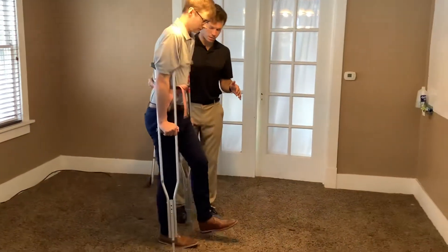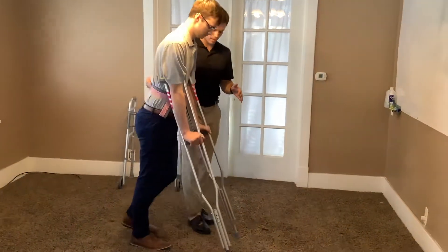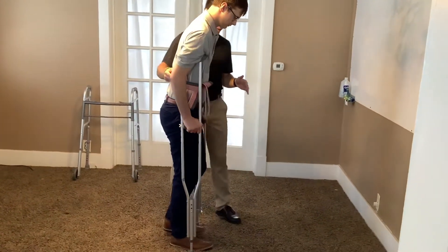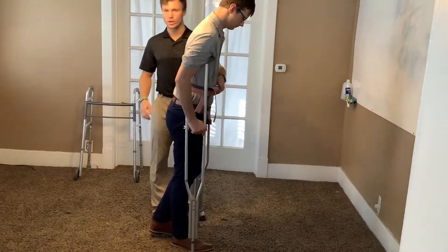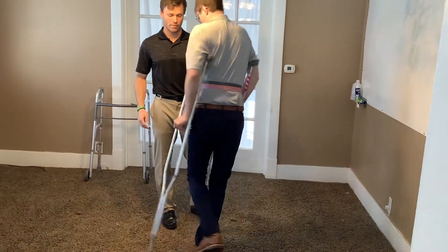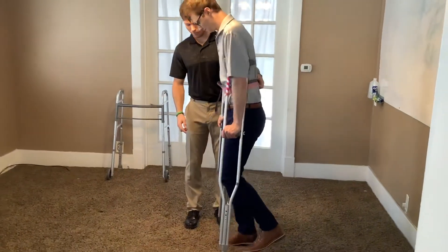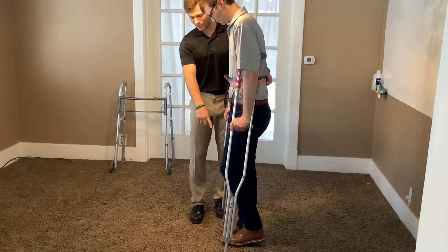Crutches, affected, unaffected. Good job. Crutches, affected, unaffected. That's the three-point gait pattern. Now we're going to switch to a three-point modified gait pattern.